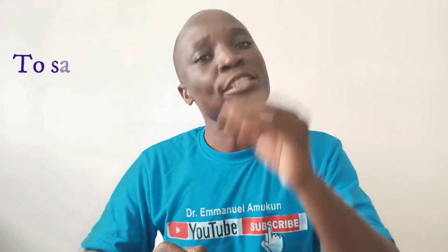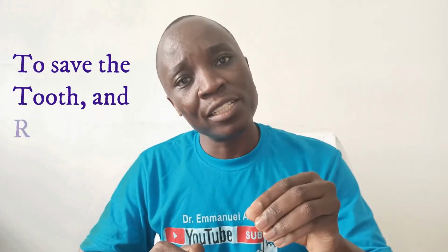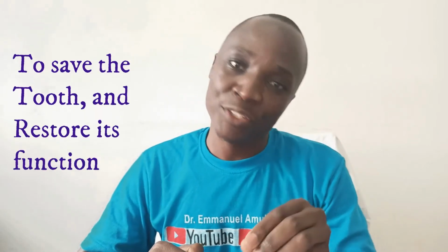So why do we need to do this root canal in the first place? The main reason for doing the root canal is to save the tooth and restore its function. So what is the actual process of root canal treatment? What does it mean to do the root canal treatment?